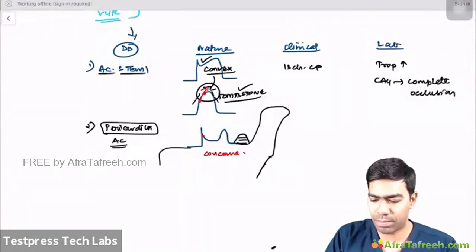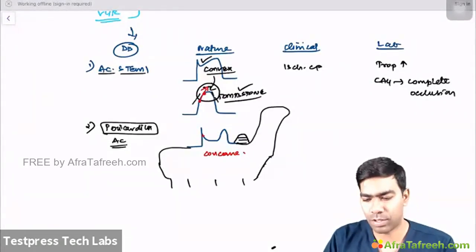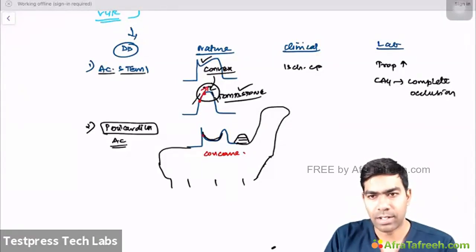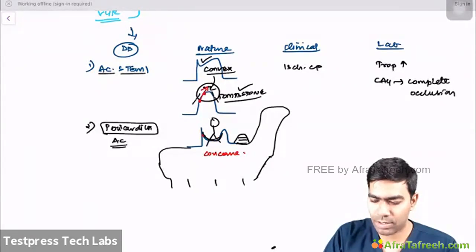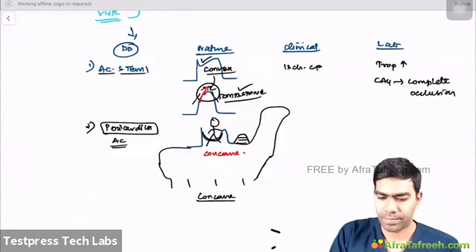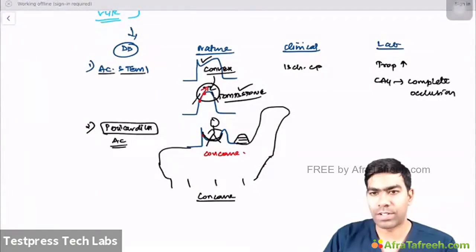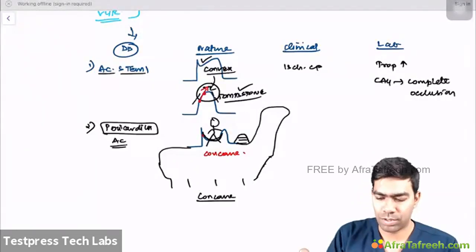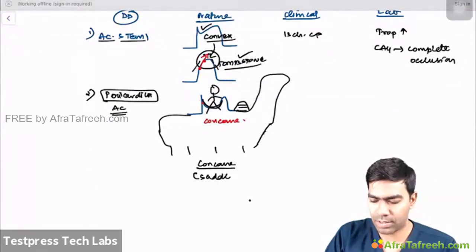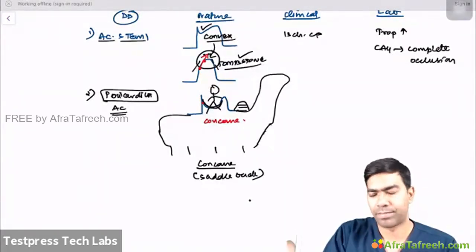If you sit on the hump, and if you're a boy, like I cannot really tell, I can only tell no, because that's painful, really. So you can't sit on the hump, and you have to sit on the saddle. Clear? So this is how you can sit on the saddle. So this is basically something referred to as a concave type of elevation. And of course, it's going to result in a saddleback kind of elevation. So concave saddleback goes towards pericarditis.